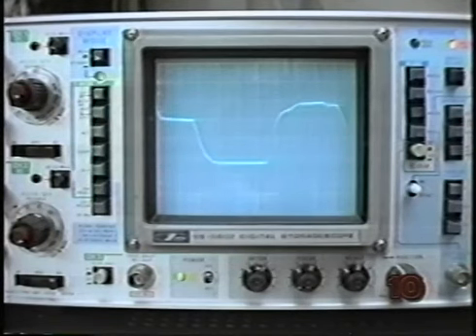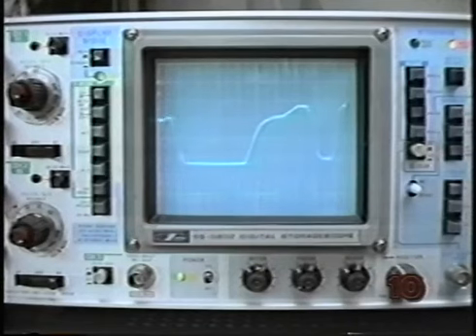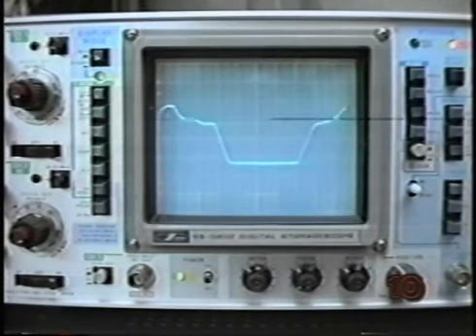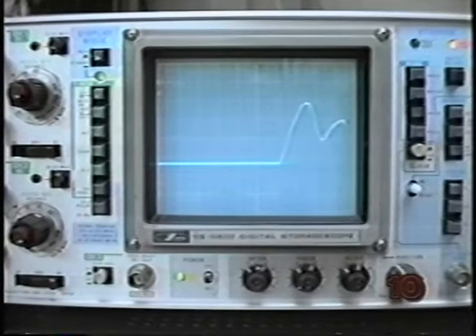Here we presented them to show you how this device works, what kind of data can be obtained, and how those data can be analyzed. Obtaining the acoustic signal simultaneously with the velotrace signal made it possible to identify the acoustic segments, and processing the velotrace signal to obtain the instantaneous velocity made it possible to identify the beginning and end of each movement.